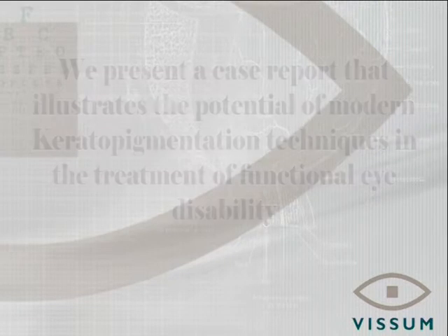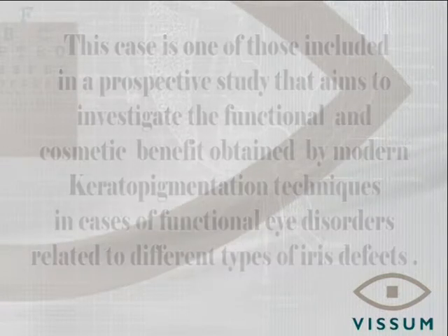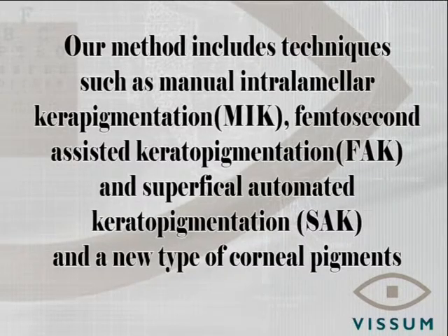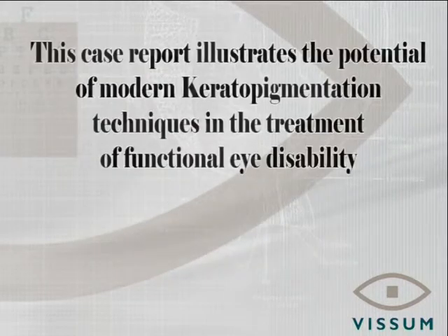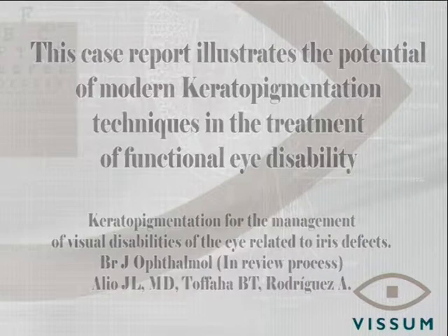of functional eye disability. With this study, we tried to investigate the functional and cosmetic benefit obtained by modern keratopigmentation techniques in cases of functional eye disorders related to iris defects, using modern techniques such as intralamellar keratopigmentation with particular instruments, femtosecond-assisted keratopigmentation, and superficial automatic keratopigmentation performed with particularly new devices. This case report illustrates the potential of these techniques in the treatment of functional eye disability.